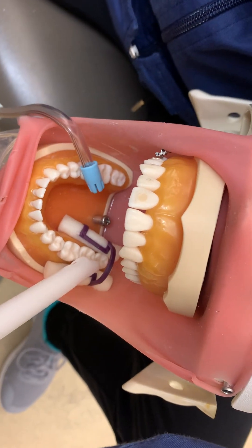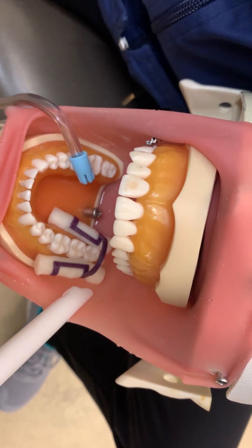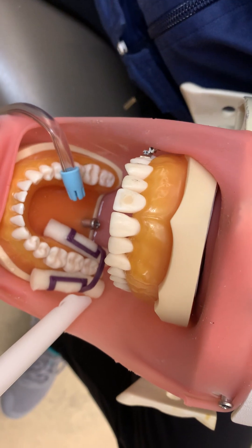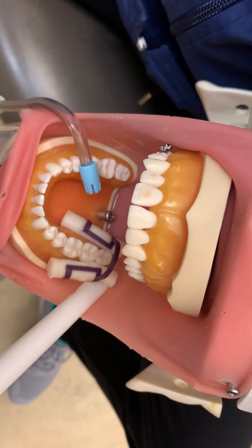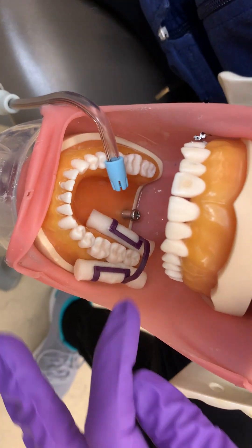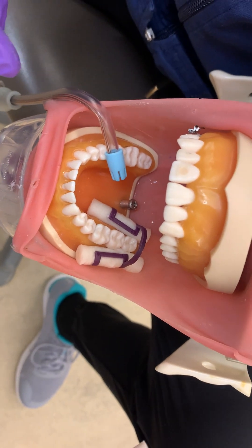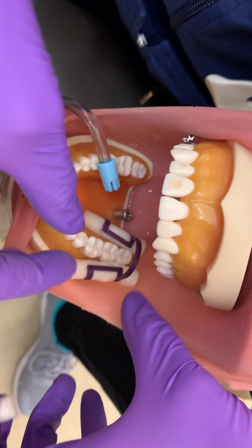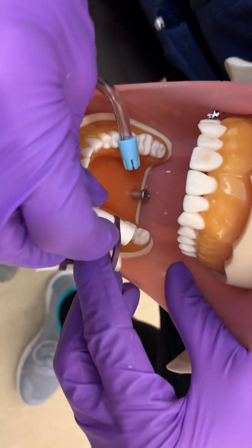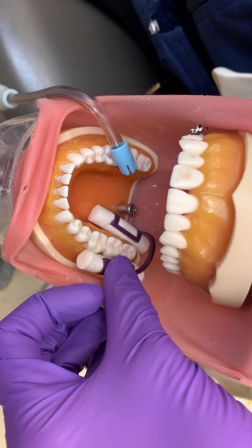She is going to dry those occlusal surfaces until she sees a dull, chalky appearance. She confirms that dull, chalky appearance. She is going to apply the sealant material according to manufacturer's directions. She will assess the need for new cotton rolls and has determined that these should stay dry in place.